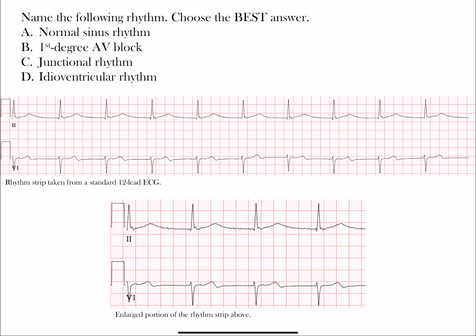To orient ourselves, we have rhythm strips taken from a standard 12-lead ECG — both lead II and V1. Lead II is an inferior limb lead, and V1 is one of those right-sided precordial leads that gives us a great short-axis view of the heart, especially the atria. These are the best leads to look at when examining for atrial abnormalities, where we look at the P waves.